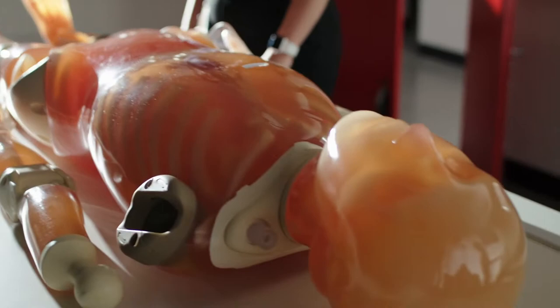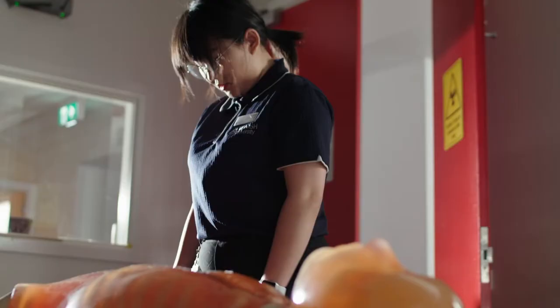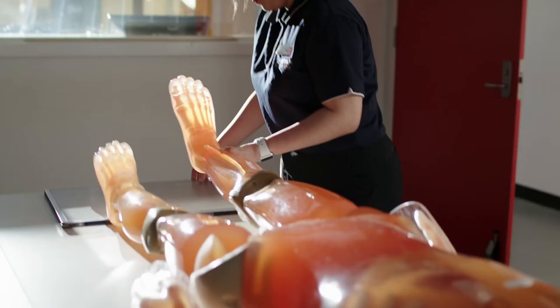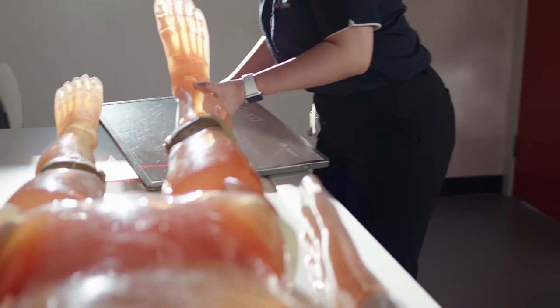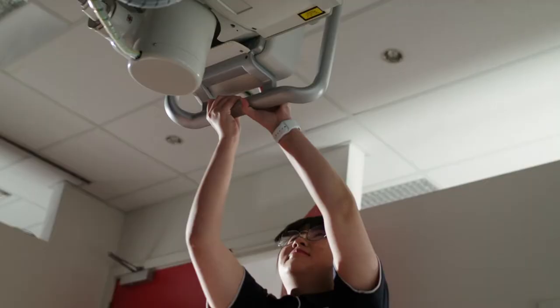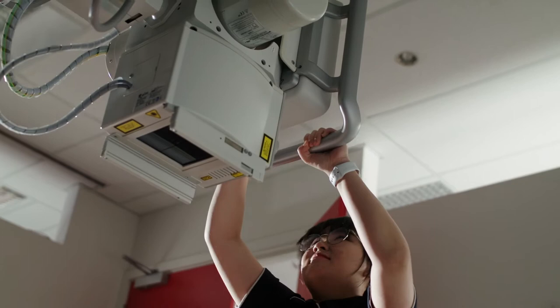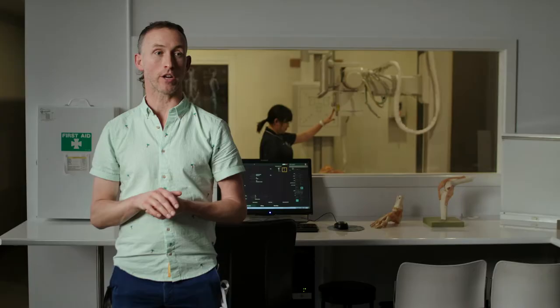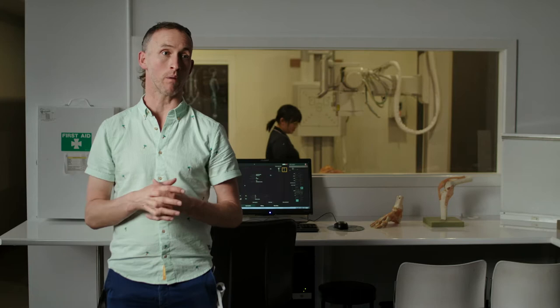Susan just raises the table up so that she can work at a safe height for herself, and she starts to position the patient. This is our imaging receptor on which our image will appear. She starts to move the x-ray tube or camera around the room and into position, and the image gets captured on the receptor then.